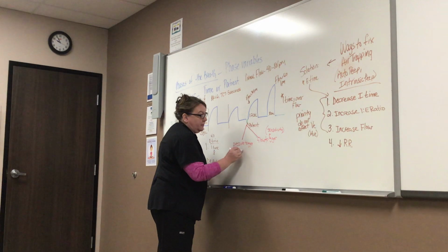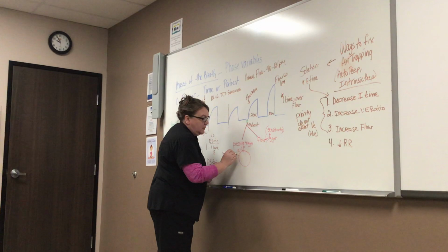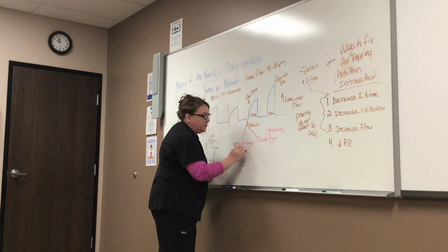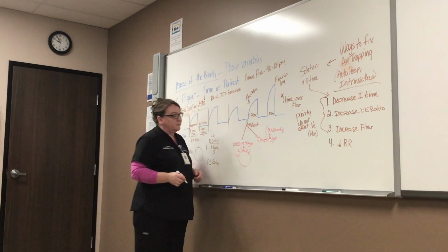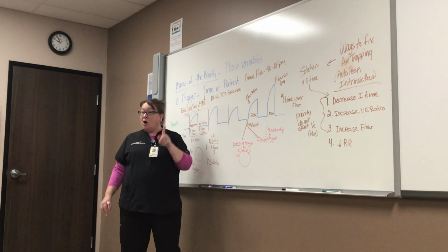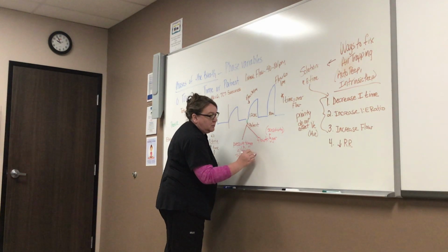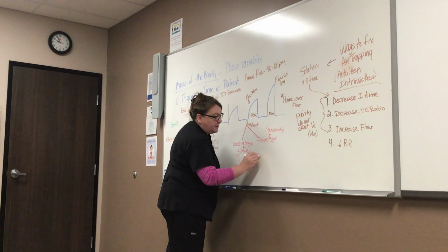It's just like, say you're at 0 here, -1, -2, -3, +1, +2, +3. Pressure trigger or pressure sensitivity, number 1 is always negative. I'm sorry guys, always negative.